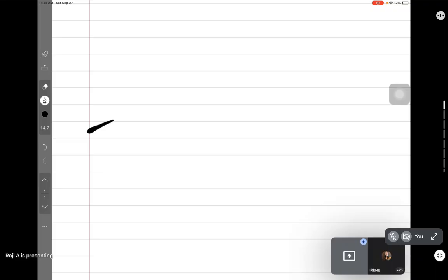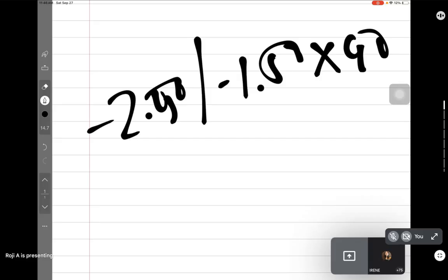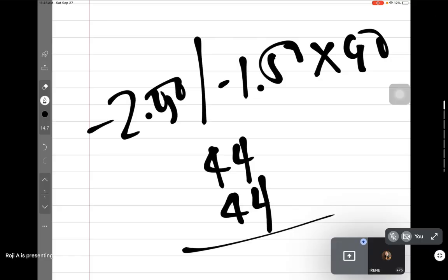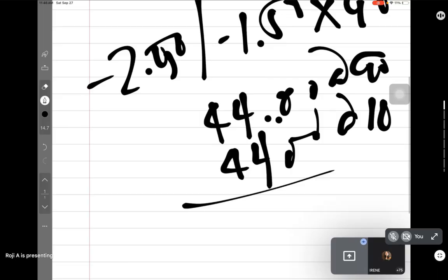Assuming I have minus 2.50 combined with minus 1.50, axis 90, and K readings of 44, 44. What will it give me, Irene?